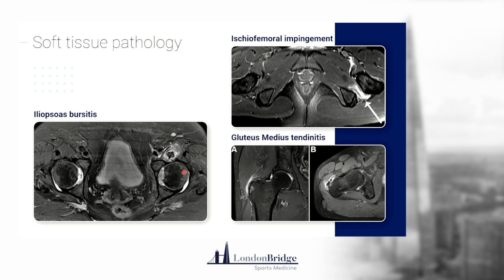I think when you are diagnosing hip flexor phenomena, you always need to be a bit careful about whether it's a joint-related phenomena that's transitioning on to the hip flexors. But in this case, actually, it was a primary hip flexor trauma.